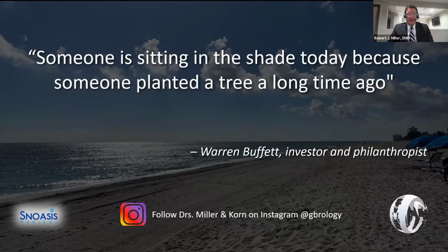Typically, when I begin a presentation, I like to start off with a quote that's relevant to the topic that I'm speaking on. Warren Buffett has been quoted as saying, "Someone is sitting in the shade today because someone planted a tree a long time ago." And albeit we're talking about guided bone regeneration, truth is it hasn't been around all that long. If you think about it, GBR, the use of barrier membrane technology to affect bone growth for the ultimate placement of dental implants, started appearing in the literature in the late 1980s, early 1990s.